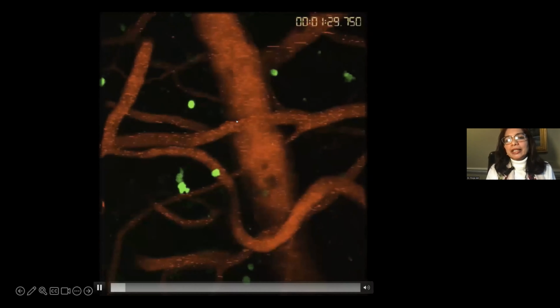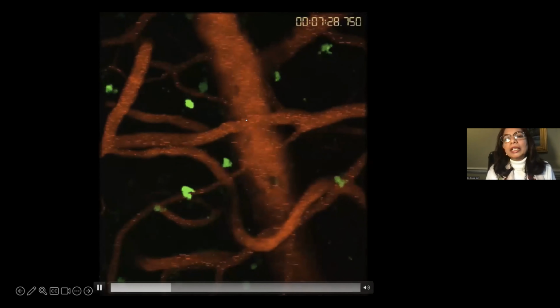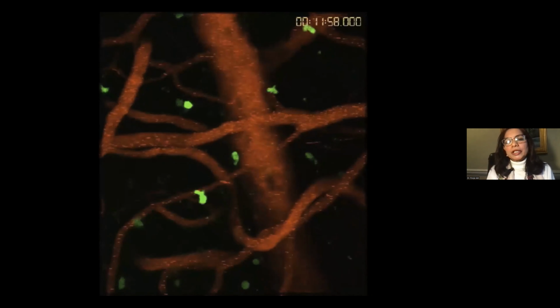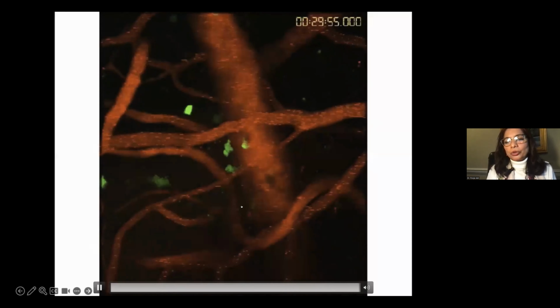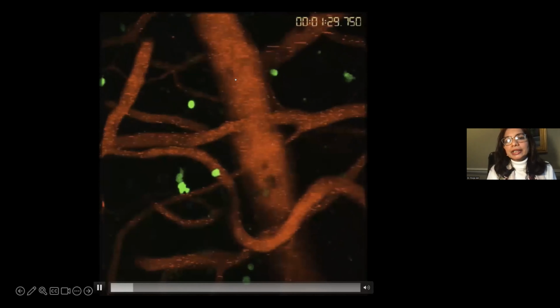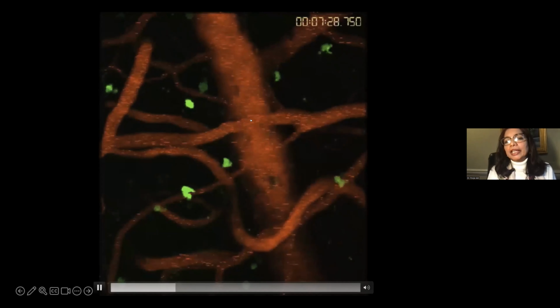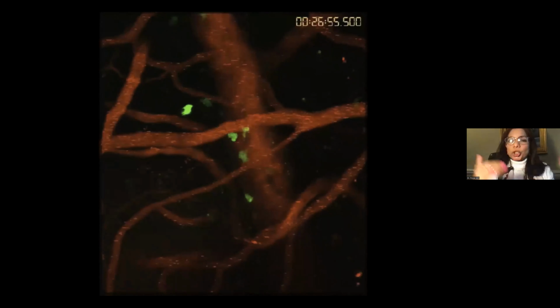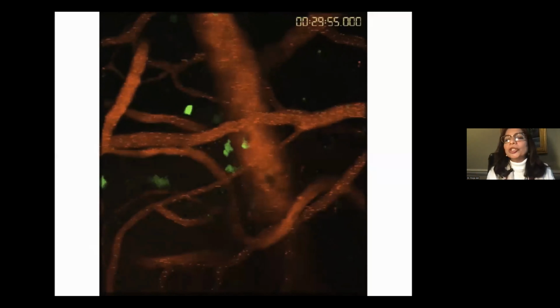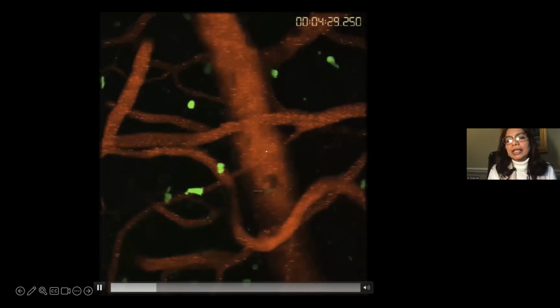What we did is create a meningeal window in the skull of a mouse, injected quantum dots to expose the meningeal vasculature, then labeled our immune cells with CFSE and introduced them IV. We noticed that when the CNS is intact, few cells cross the blood-brain barrier, and when there is no problem in the brain, no inflammation, they come back. So we showed why people thought that the CNS has no immunity: these cells undergo constant surveillance, but they come back to the periphery.